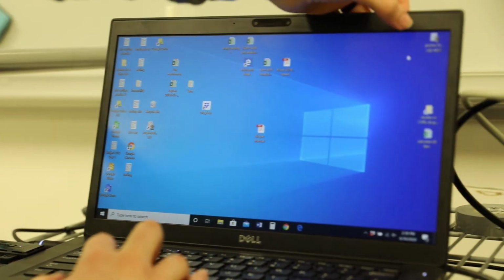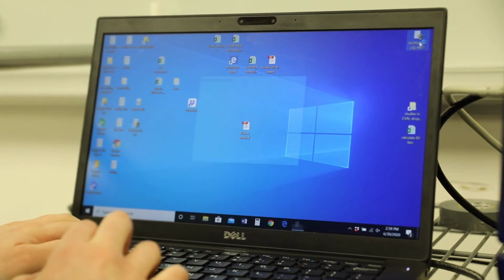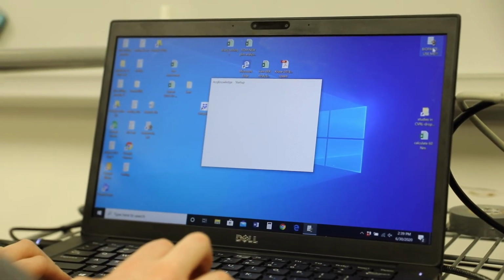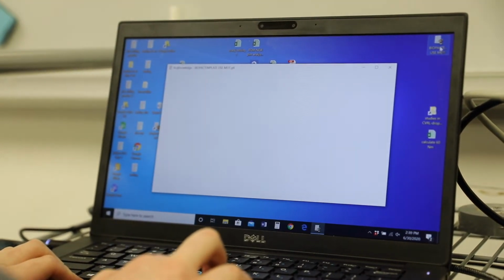We're going to come up here to this BioPack file and double click to open it up. And this is just a generic file that we're going to save for the specific subject.